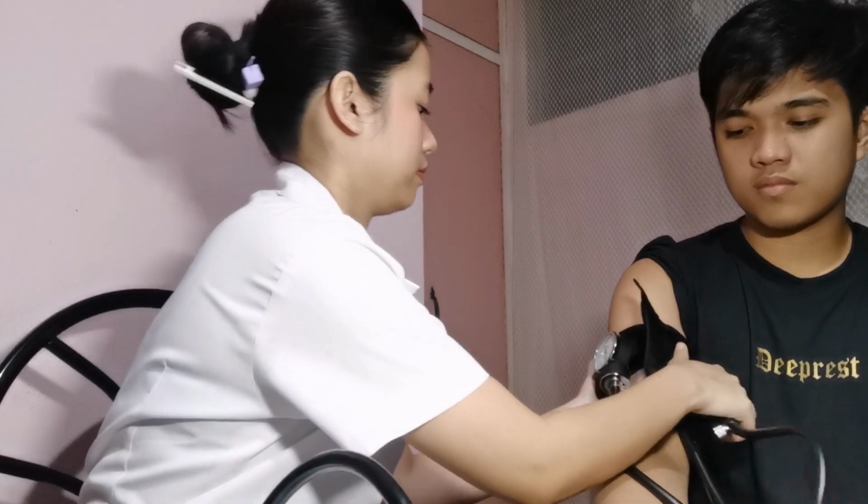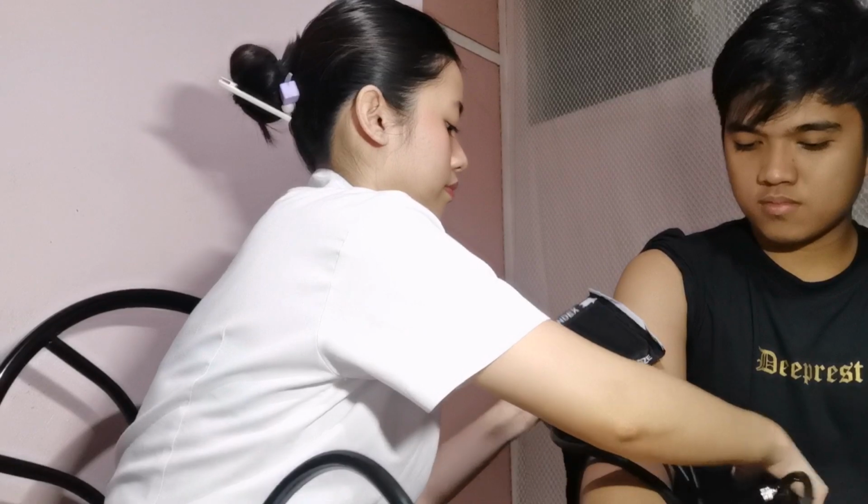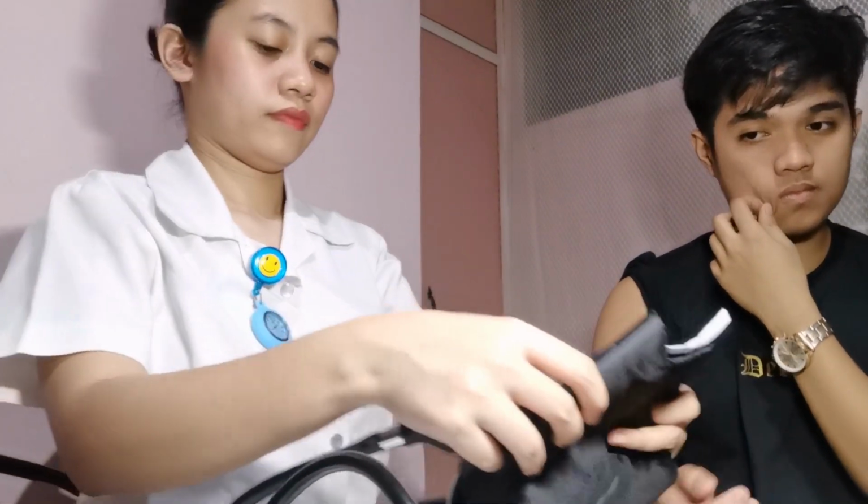So the reading is 120/70. Deflate the cuff completely and jot down the blood pressure reading. Replace the patient's clothing if needed. Cleanse the thermometer according to agency policy and return all the equipment for vital signs taking to their proper place.